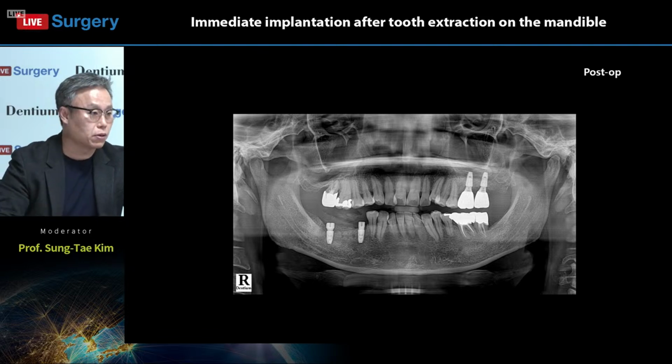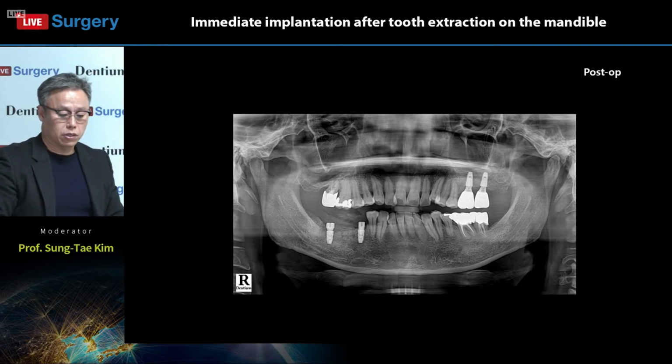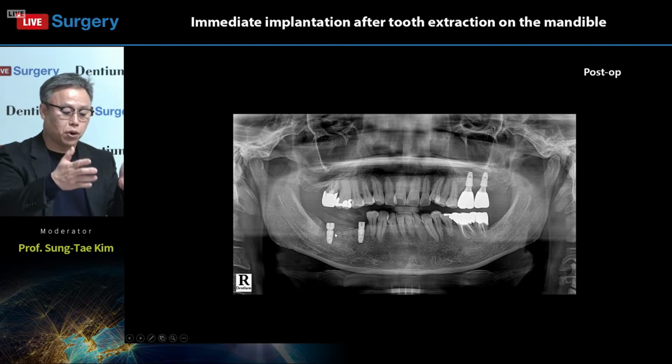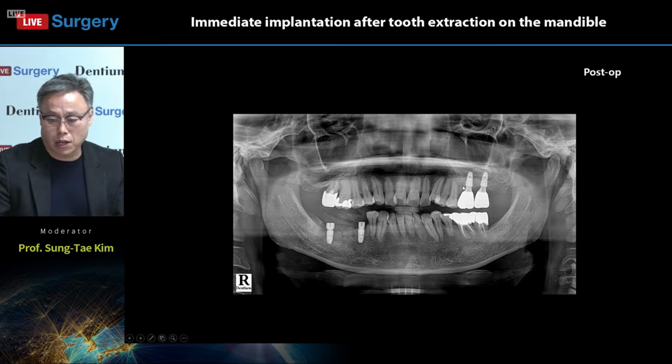getting the primary stability, because of three reasons. One is fixture shape, the other is surface area, and the last one is thread design, fixture thread design. If you see it, the middle of the fixture looks like a dome shape. It's bulky. It's good for getting the primary stability. The superline is a very good implant. My favorite implant is a tapered implant, but you can see the bright implant in the middle is a little bit bulky.